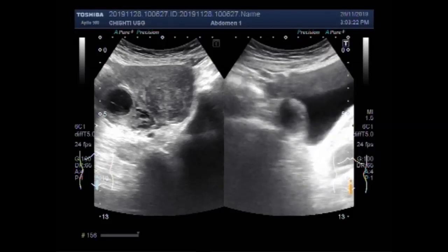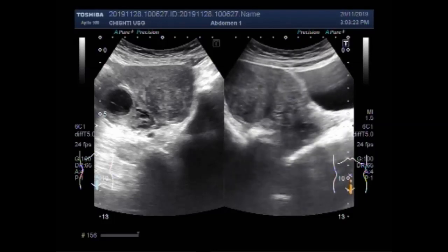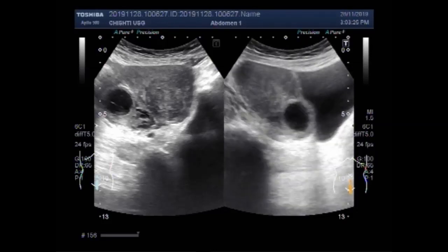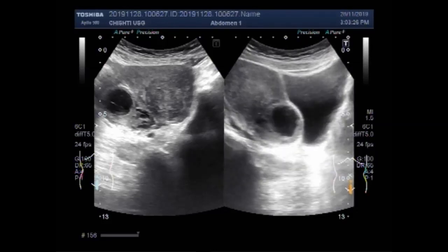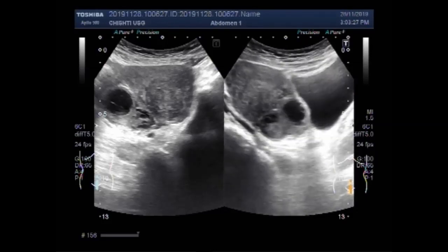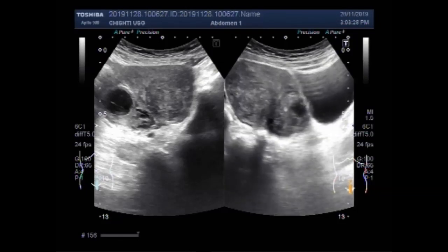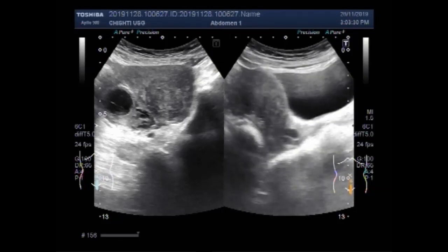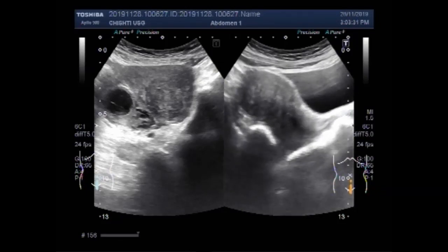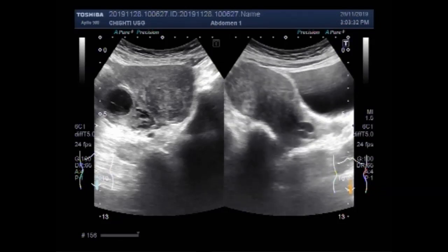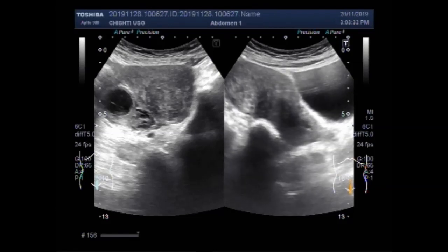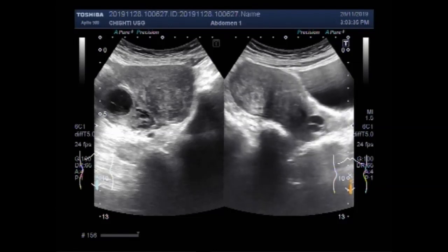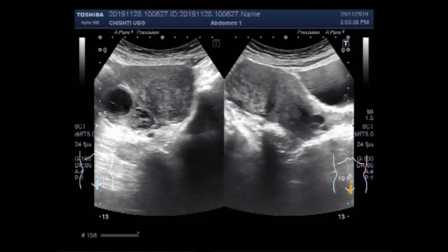To get the exact size of the finding — mass or cyst — you will need a bit of probe handling and patience.